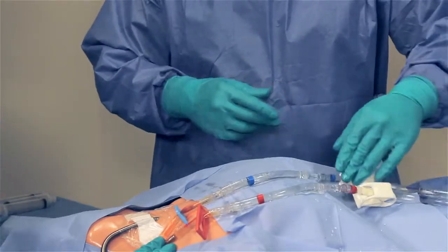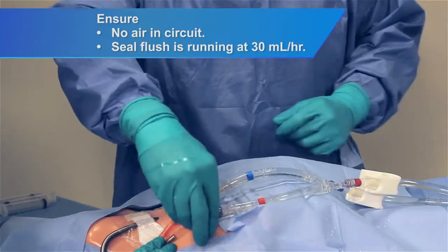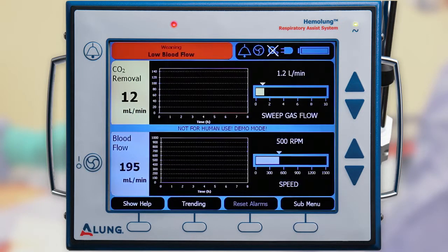Once the connection is complete, make sure all clamps are open. Press and hold the pump start/stop button to restart the pump and resume therapy.